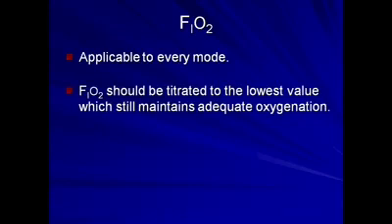still maintains adequate oxygenation. What constitutes adequate oxygenation varies depending upon the patient's pre-existing physiologic substrate and upon the patient's current situation. For example, a target O2 saturation in a previously healthy patient now in cardiogenic shock from an acute MI may be 97% or higher, while the target O2 sat might be only 88 to 92% for a patient with chronic COPD on home O2, now with acute on chronic respiratory failure.